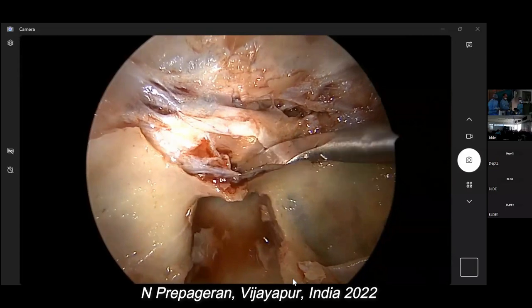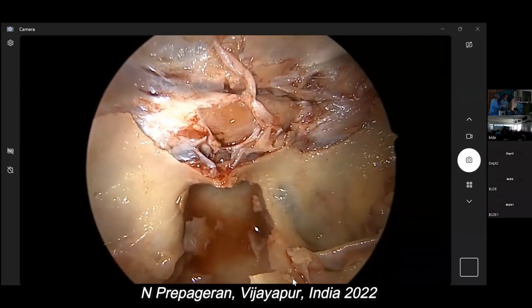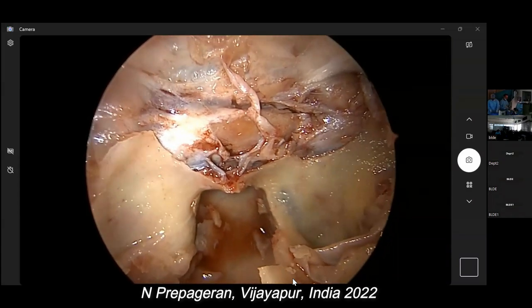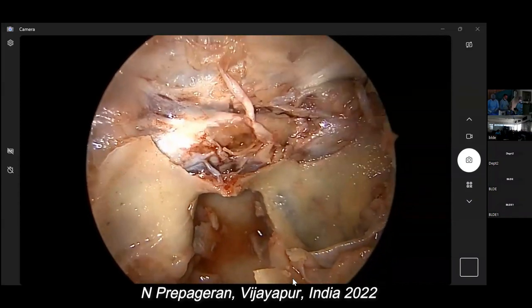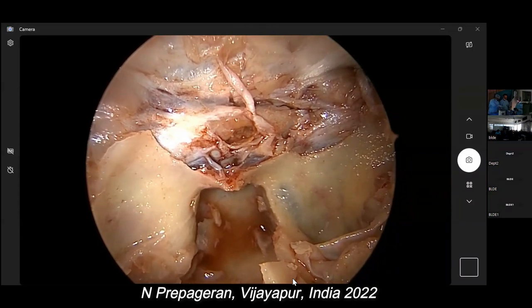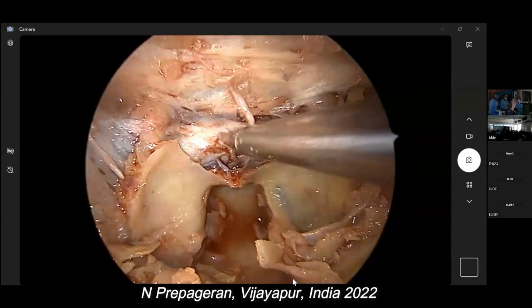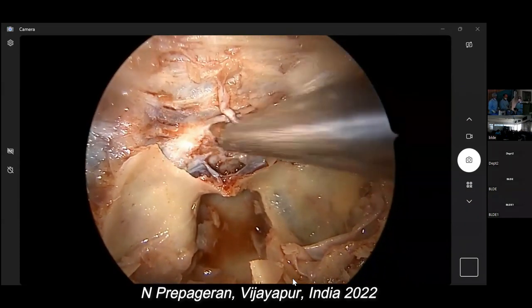Give me a Blakesley. Give me suction after this. And then remove the tumor. Okay, suction. That's for biopsy. And then you take suction and remove the remaining tumor until all the tumor is gone.